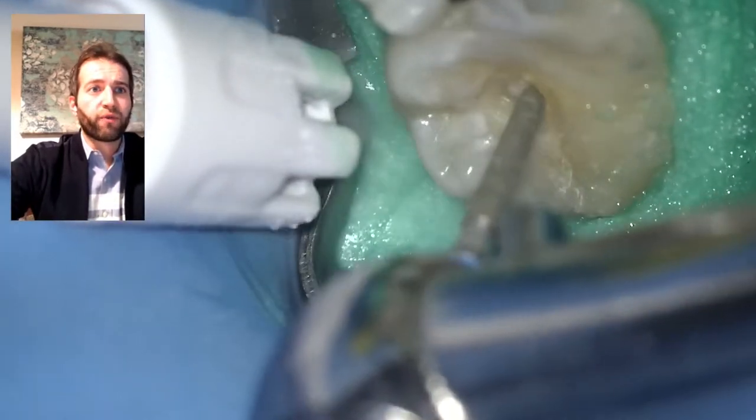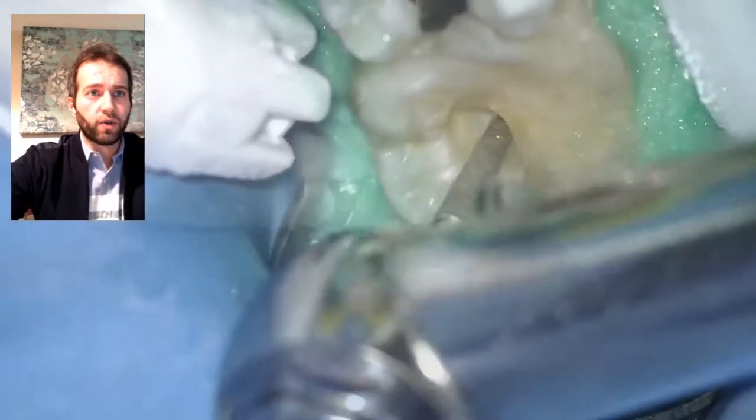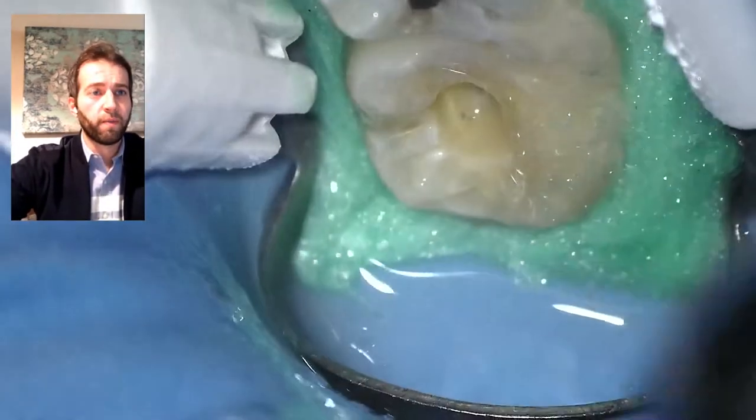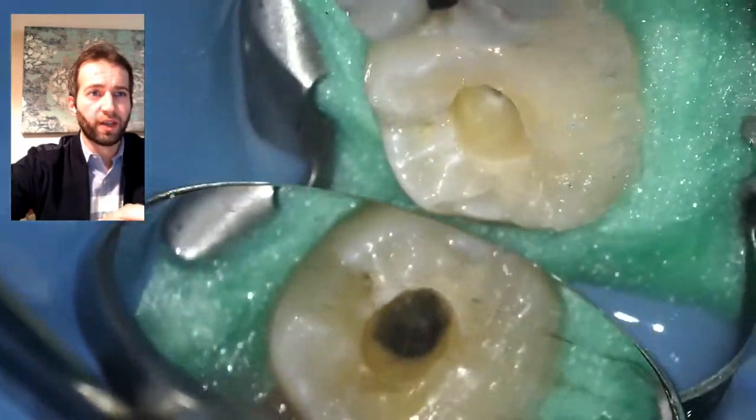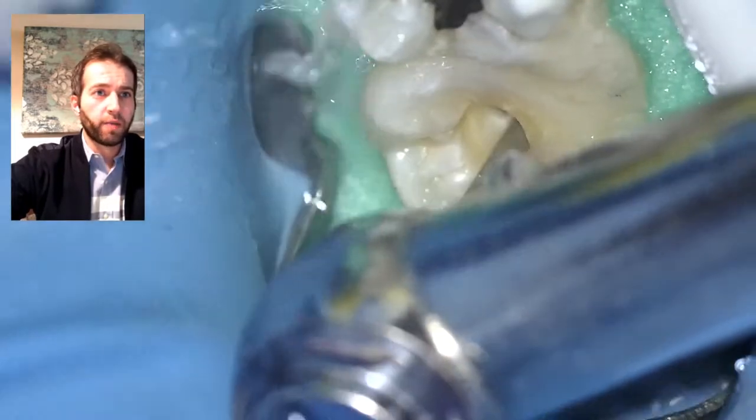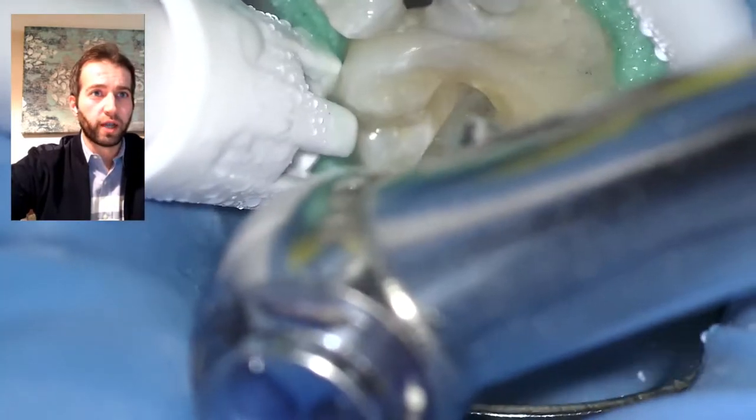I'm removing that Fuji 9 — you can distinguish it from the tooth structure. I like to remove all the Fuji first before I take the cotton pellets out, just so nothing is sticking. You can see there's still a little bit left, so I'm going back with my bur to make sure it's nice and free.